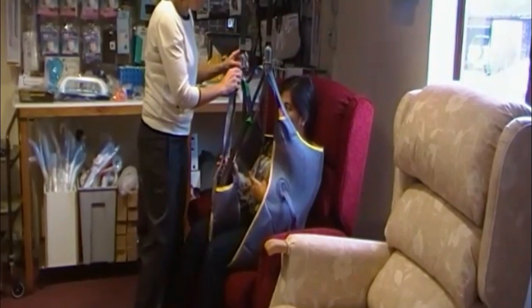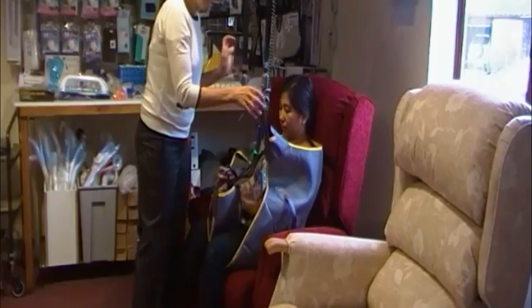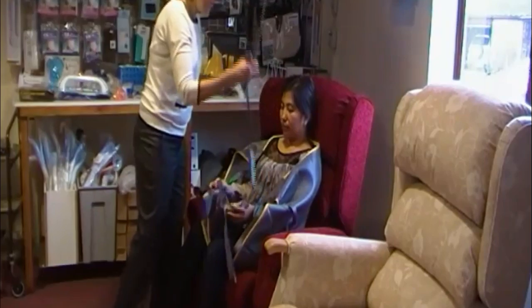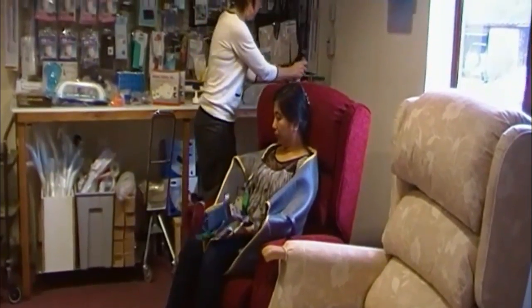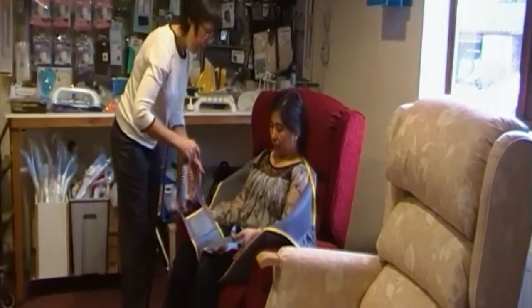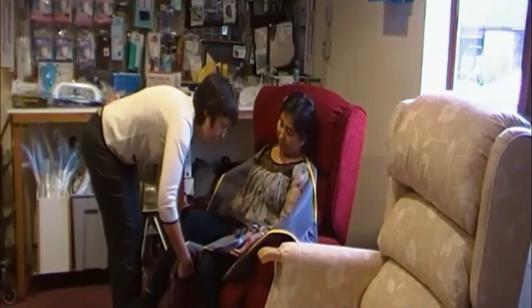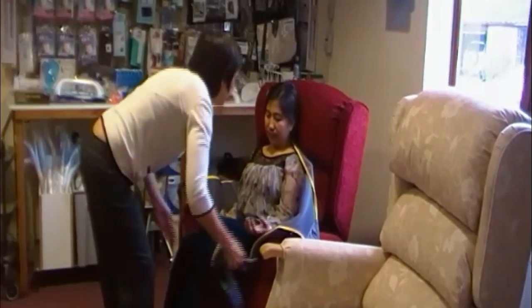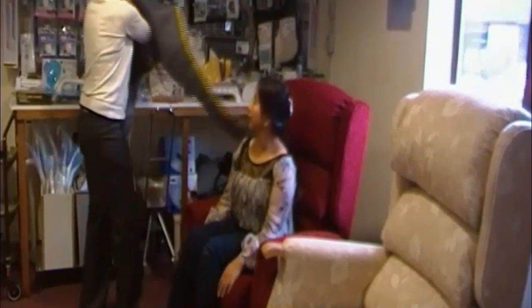So we'll get down a little more so we can get the sling off easily. That's it. Take this back to its charging point. And we'll take this. You won't be comfortable sitting on this all day, so we'll slide this back, pull it out, pull that one too. You lean yourself forward, pull the sling out. How was that?